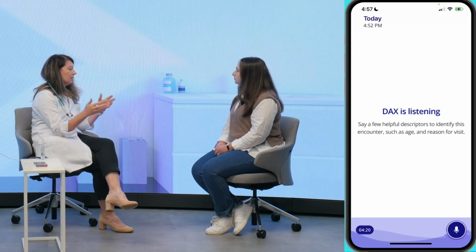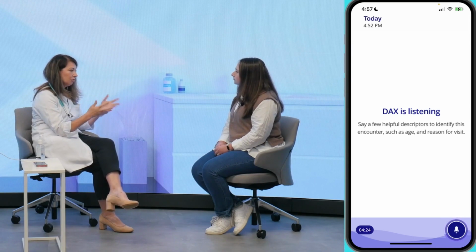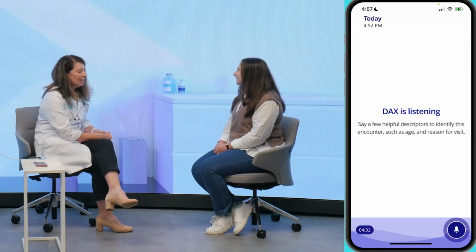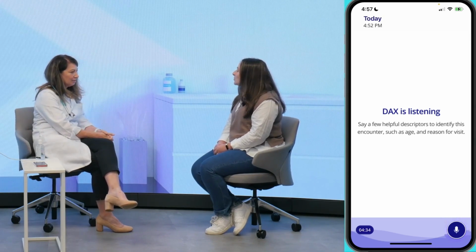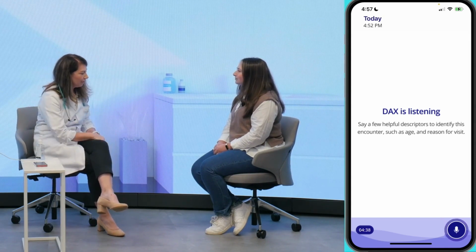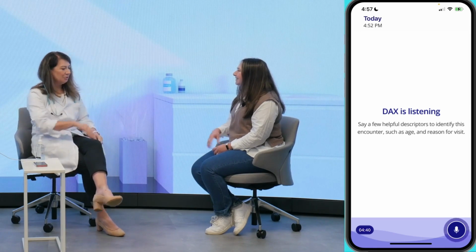And then for your third problem, your history of pulmonary embolism, follow up with your hematologist and have your INR checked regularly. I'm assuming you do all of that. Yes. Okay. All right. Any questions about any of that? No, it all sounds good. Okay, great. Well, the nurse will come in and we'll get you checked out, okay? Okay. All right. Good to see you. Nice to see you too.